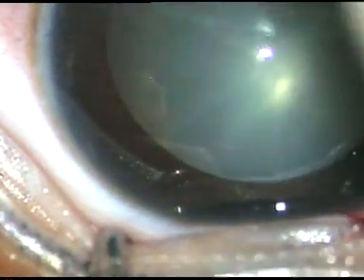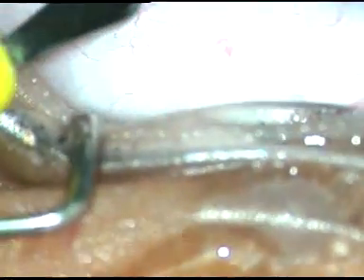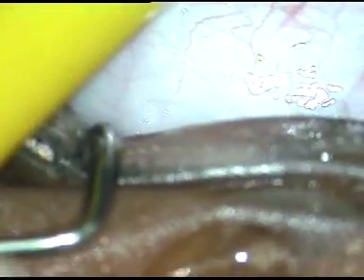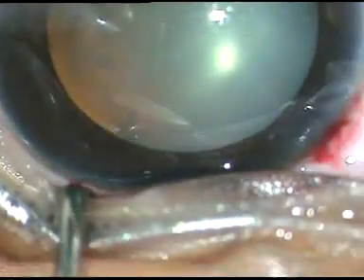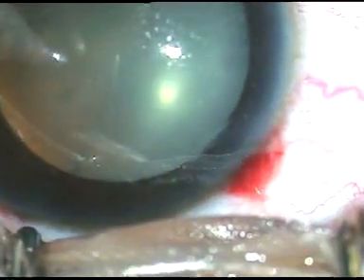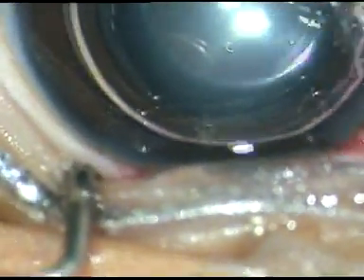The main incision has been made. One side port is being made on the left side of the main incision, and another side port on the right side of the main incision. Now I am going to stain the anterior capsule with trypan blue dye, and I use an air bubble to stain the anterior capsule.